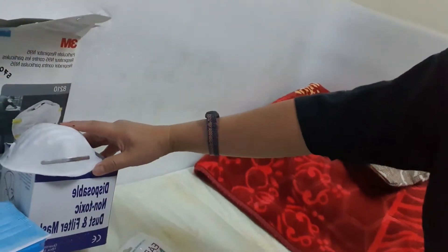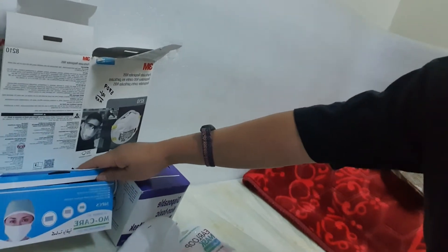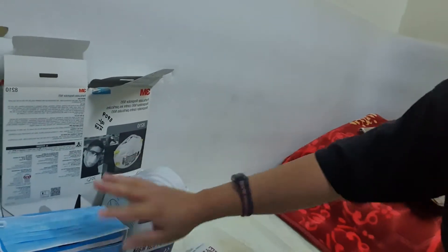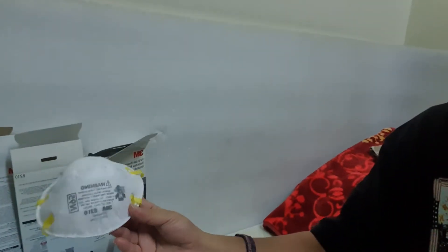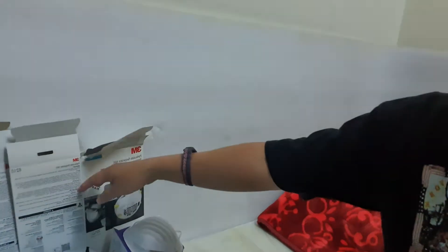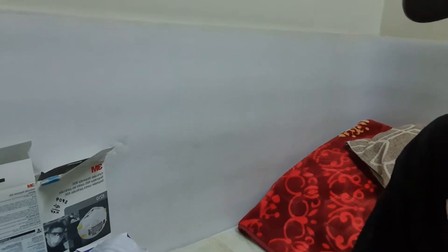This is a disposable mask — this is a dust mask. This is a surgical face mask, one box. This is all I have — one more piece — so I have that for collection.